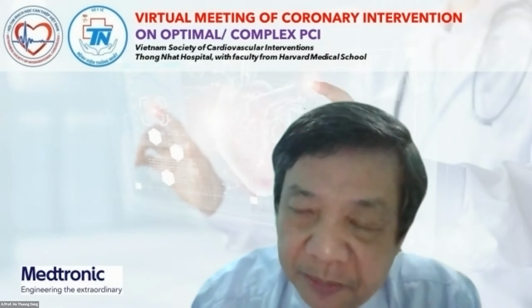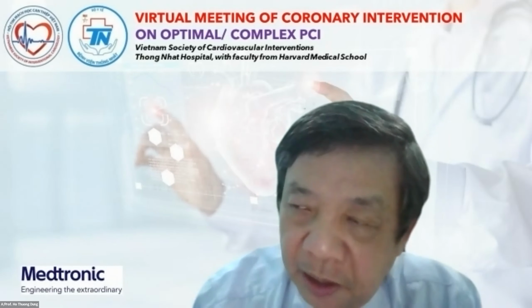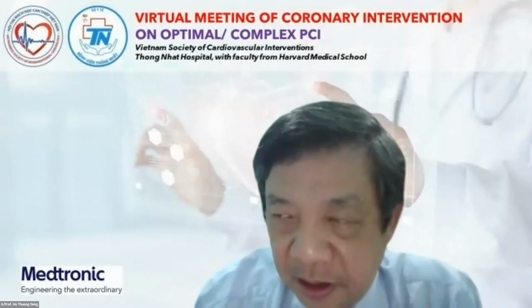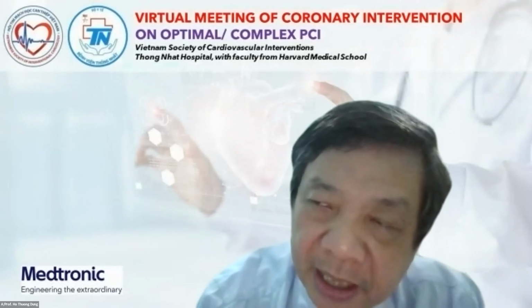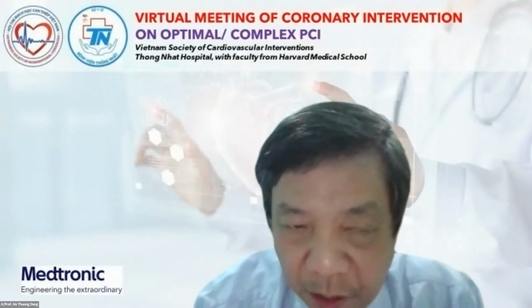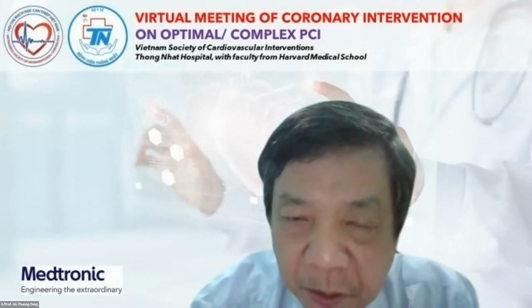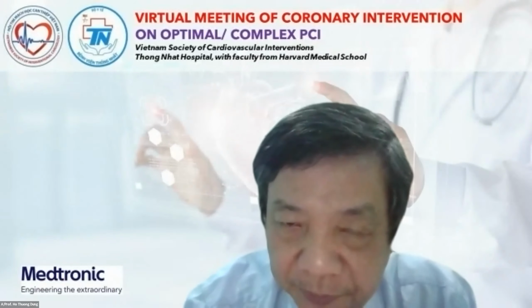Can you share some experience, such as which kind of in-stent stenosis lesion we can use it in? Because I think in some cases, where the stent has an acute angle or is tortuous or long and diffuse, the Rotablator very easily gets stuck.